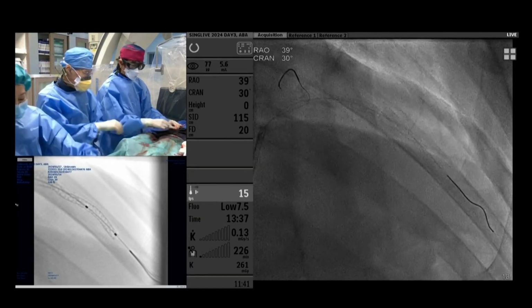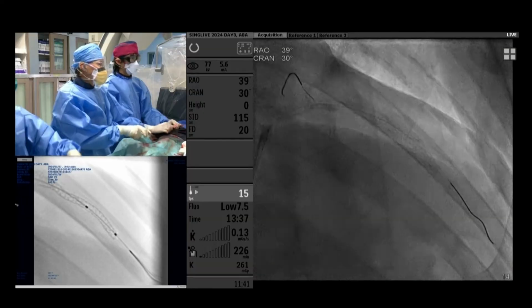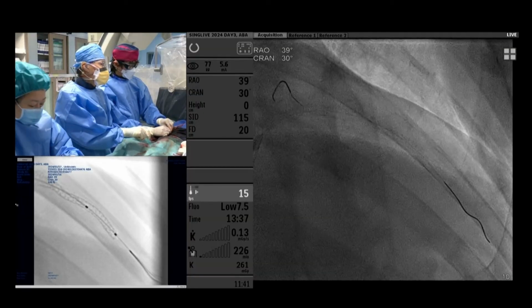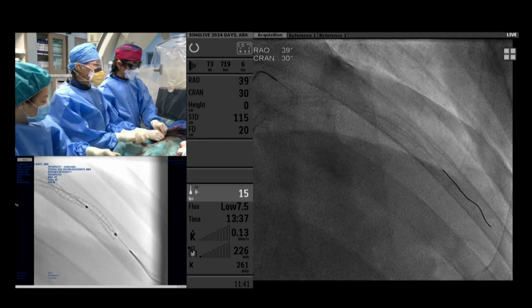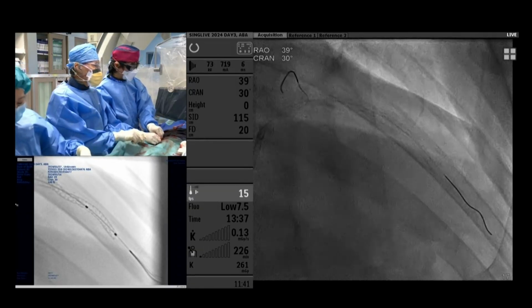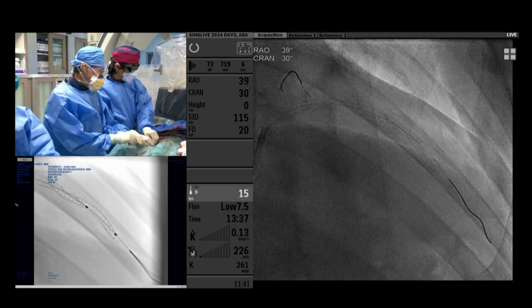So what about the Circ wire? You don't want to remove it yet, or just want to wait still? Oh yeah, we will POT first, and then I'm not sure, you can use our other wire that we pulled out to rewire, and then we can remove the Circ wire after.